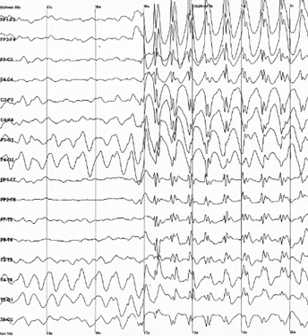EEG is relatively tolerant of subject movement, unlike most other neuroimaging techniques. There even exist methods for minimizing, and even eliminating, movement artifacts in EEG data. EEG is silent, which allows for better study of the responses to auditory stimuli. EEG does not aggravate claustrophobia, unlike fMRI, PET, MRS, SPECT, and sometimes MEG.